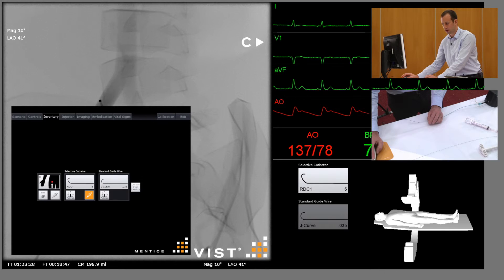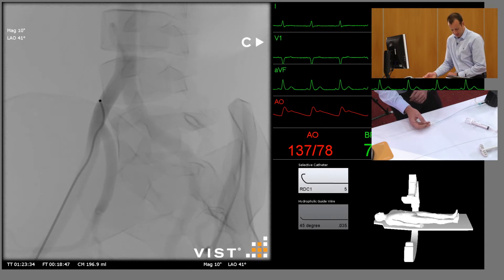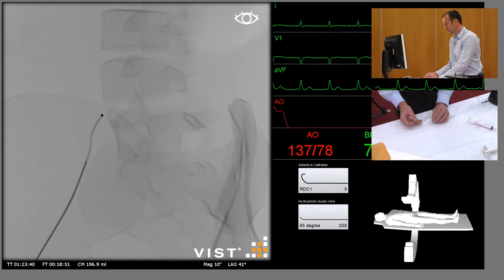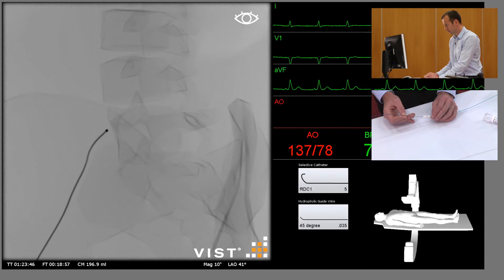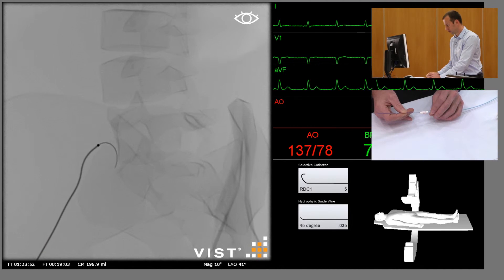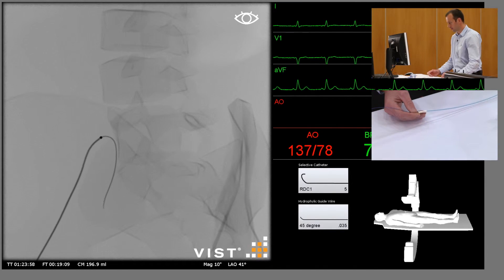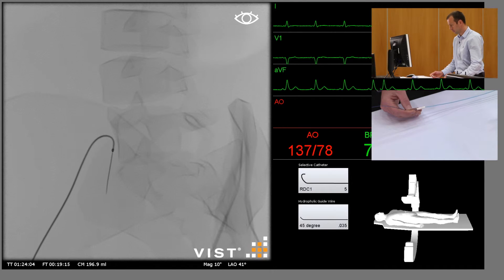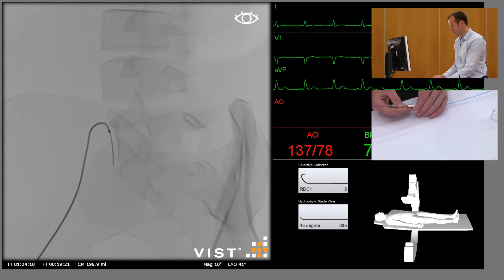I'm going to change the guide wire for a hydrophilic angled guide wire — something more appropriate to catheterize the internal iliac artery. Reinsert it. As we pull back on the catheter to torque it so it falls into the origin of the vessel, gently advance the guide wire — just far enough to provide stability to advance the catheter into the origin — and adjusting the torque on the catheter to allow it to stay in place.